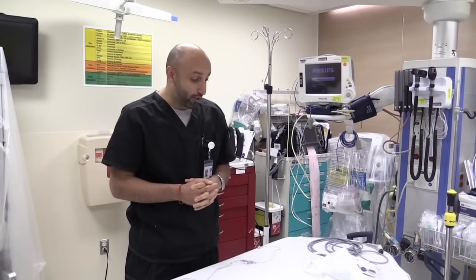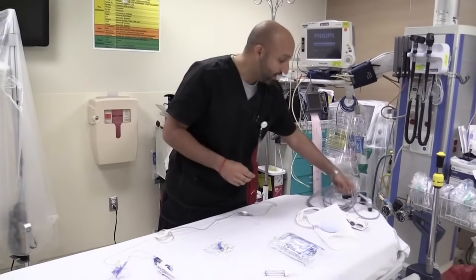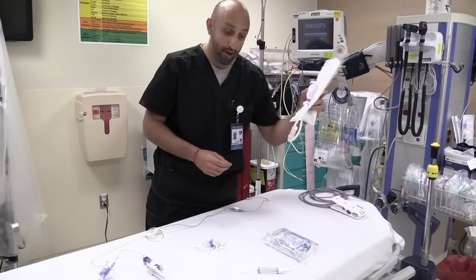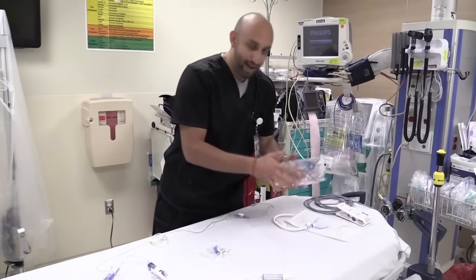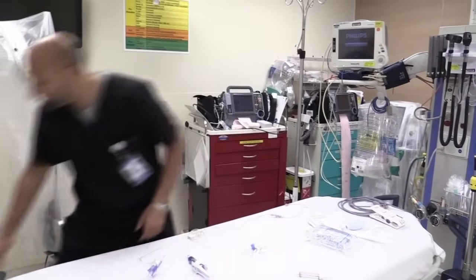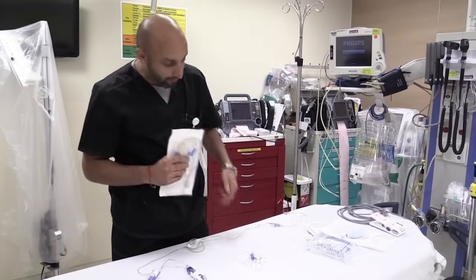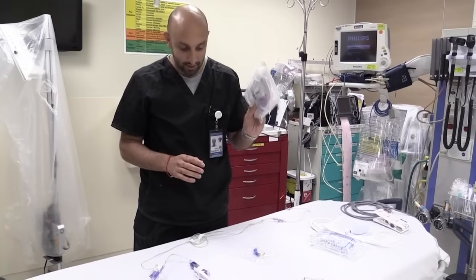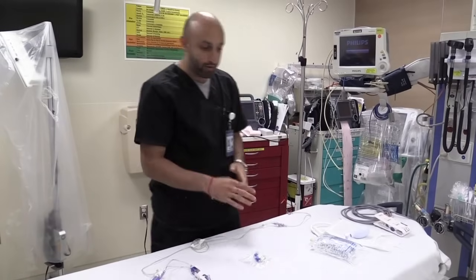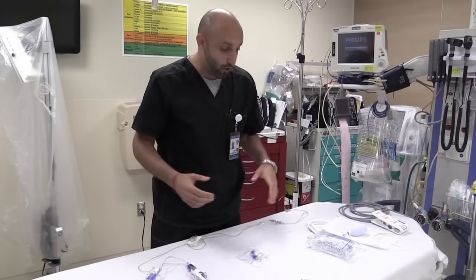So the first thing you want to do is get all your equipment ready. There are essentially five things that you're going to need: a pressure cable, a transducer holder, a pressure bag, a bag of 500 cc's of normal saline, as well as your tubing and your transducer kit, which should come in one of these. It comes with a packet that has certain caps in it as well, which we'll go through in a bit.